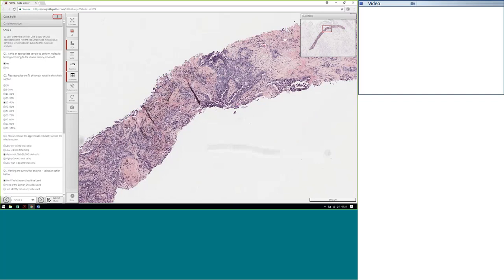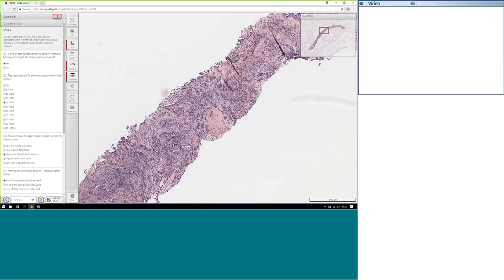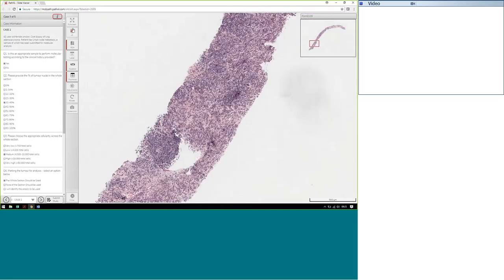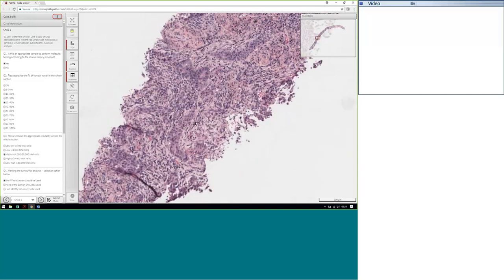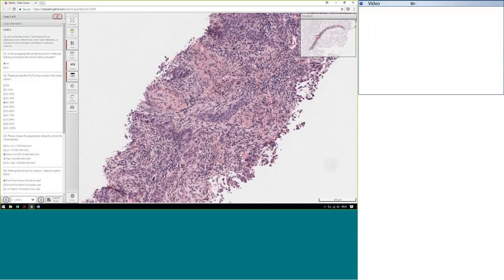This then gives a resulting cellularity, tumour content of between 1 and 20%. Again, difficult to assess, particularly when it comes down to if we include this sort of material where there's a higher concentration of lymphoid cells as aggregates. So we are going for between 1 and 20%, taking the majority of the sample.